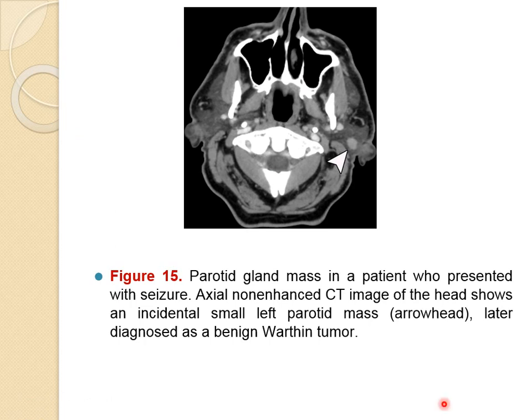Here in the parotid gland, we see a mass in a patient who presented with seizure. It was an incidental finding, a small well-defined mass in the left parotid, later diagnosed as a benign Warthin tumor.